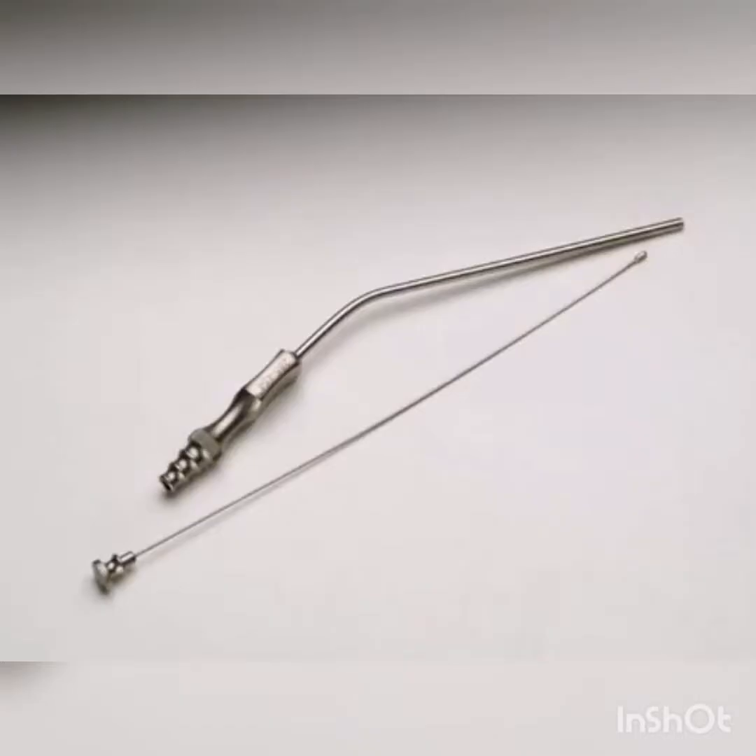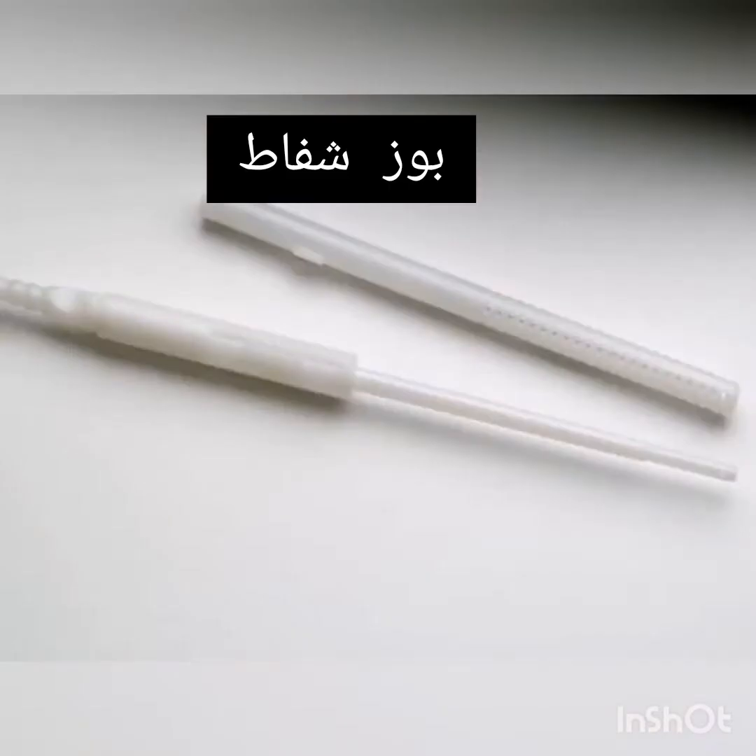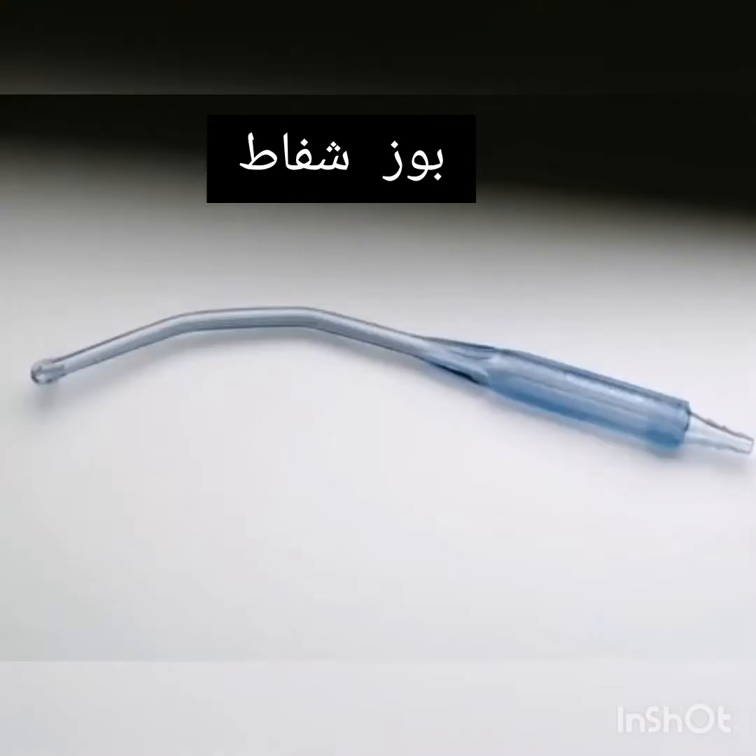Frazier Suction Tip. Pool Suction Tip. Yankauer Suction Tip.